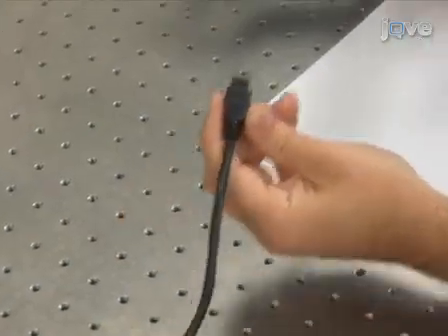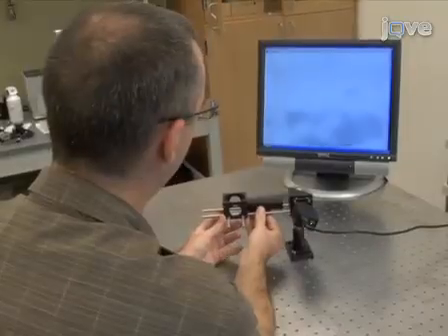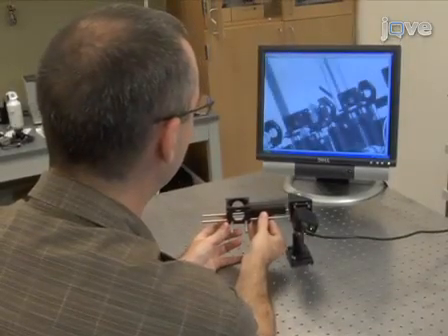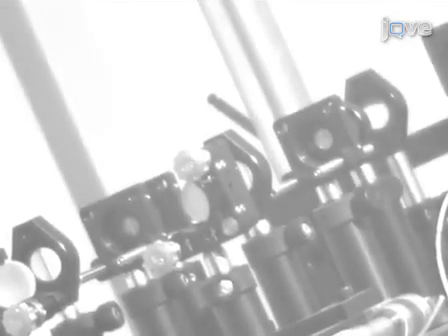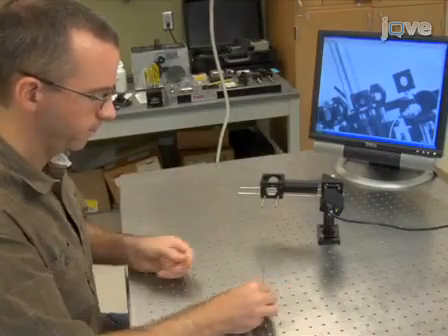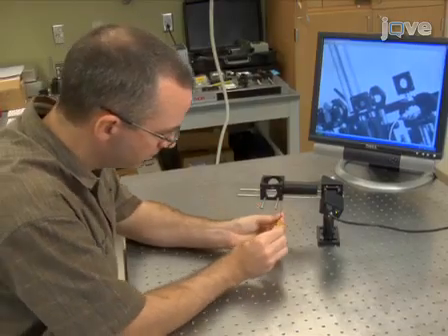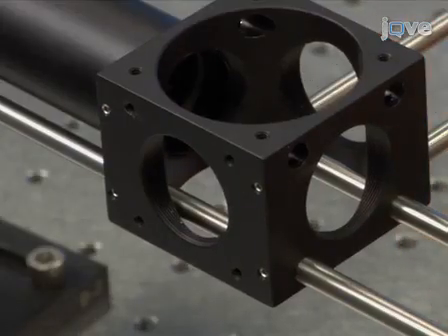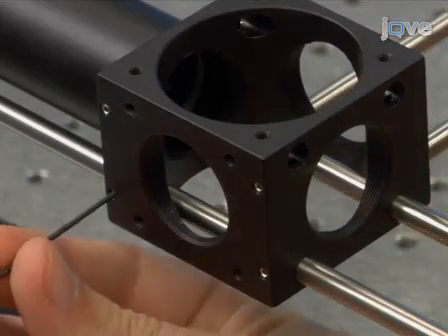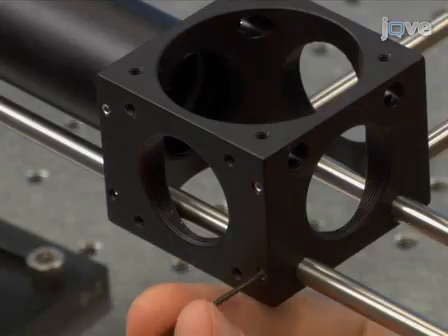Connect the camera to a computer and view the image on screen. Direct the cage assembly at a distant object and slide the cage cube along the rails until an image of the object appears in focus. Use a screwdriver to tighten the 4 screws located on the sides of the cage cube. These screws grip the rails when tightened, holding the cube in position. This will ensure that the tube lens will form a focused image of the fiber bundle on the camera when combined with the infinity-corrected objective lens.